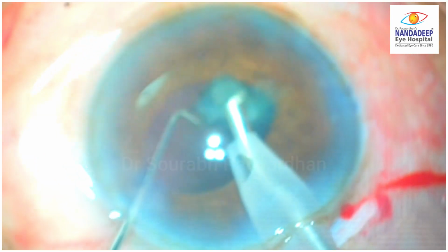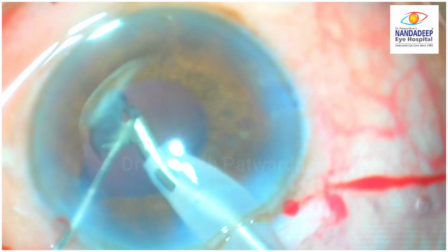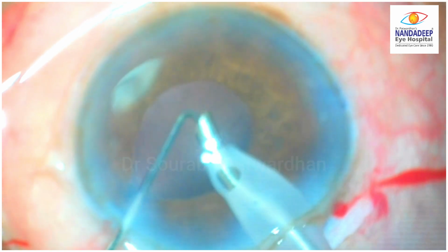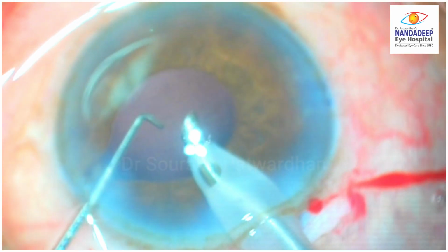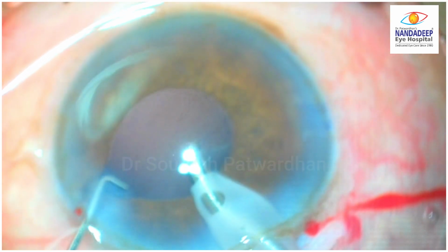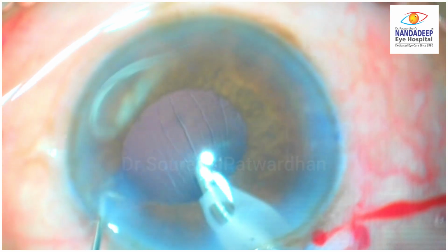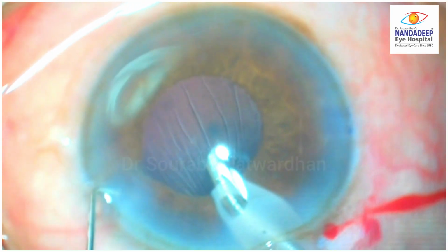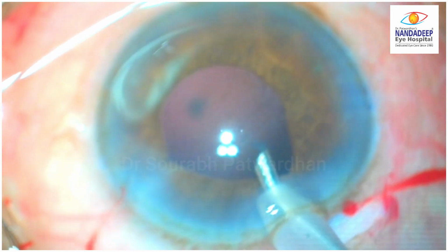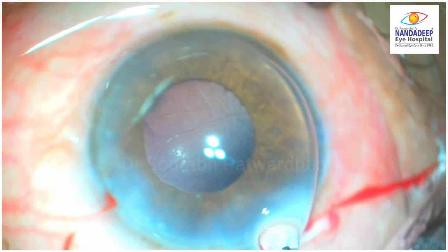At this point also you can just wait, you can put OVD and continue with the phaco, but here the PC at this vacuum was relatively stable and could complete the phaco emulsification. So the important thing at this point is to detect that the posterior capsule is bulging and make the necessary changes in the parameters. Now as the surgeon withdrew the phaco probe, you can see that there was a little tensed posterior capsule, though intraocular pressure was still not high.